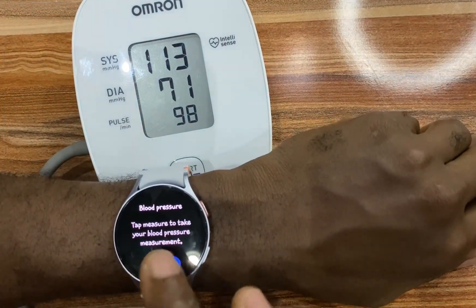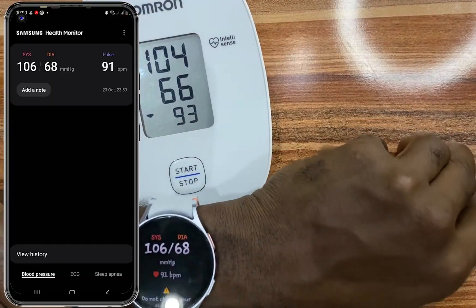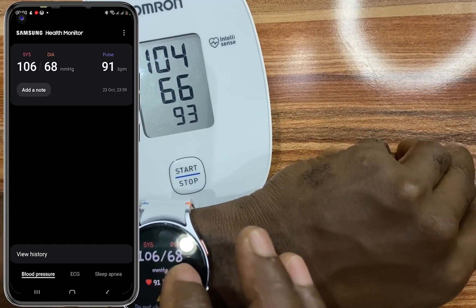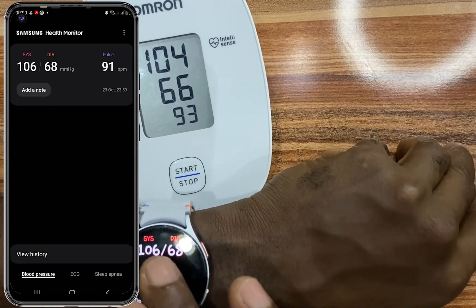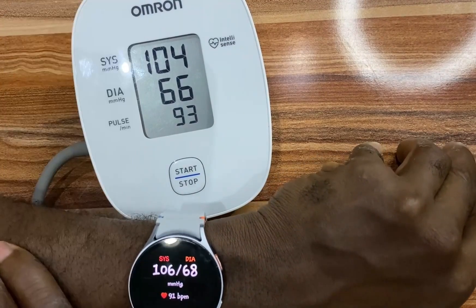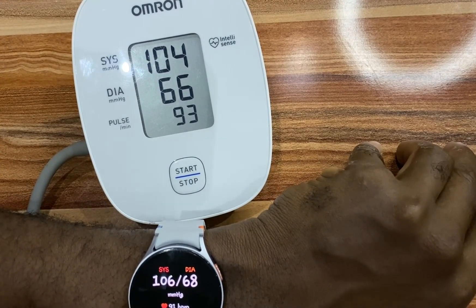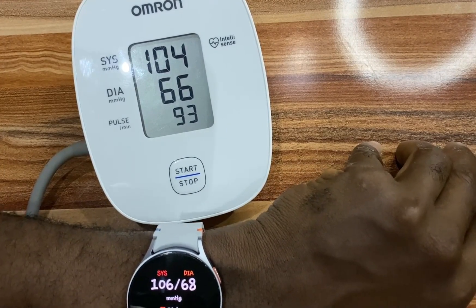I'll go ahead and tap on Measure. As you can see, the measurement on the watch is almost the same as what we have on the Omron blood pressure monitor. That is how you can install and set up blood pressure measurement for your Galaxy Watch.